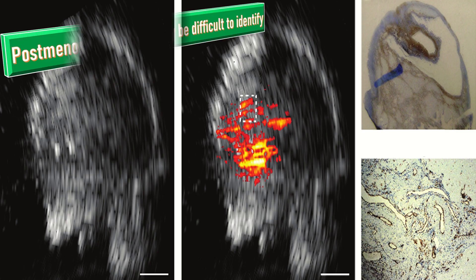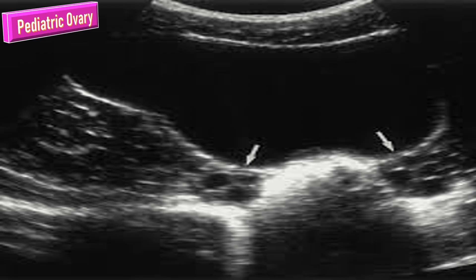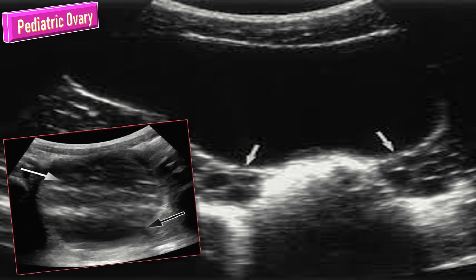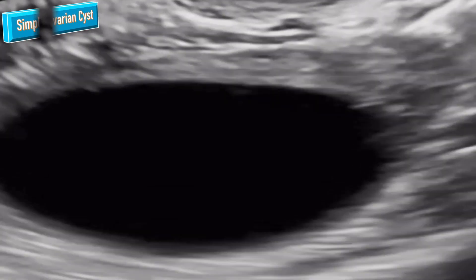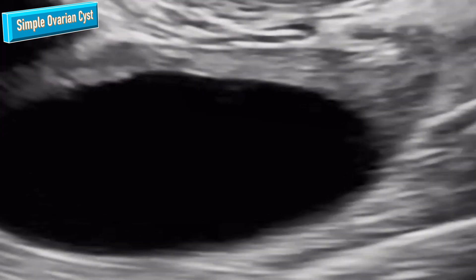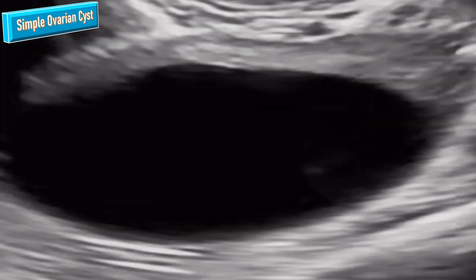The postmenopausal ovary can be difficult to identify because of the absence of follicles and reduced size. The pediatric ovary will have multiple small follicles.